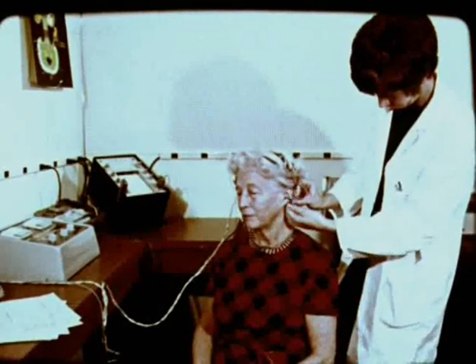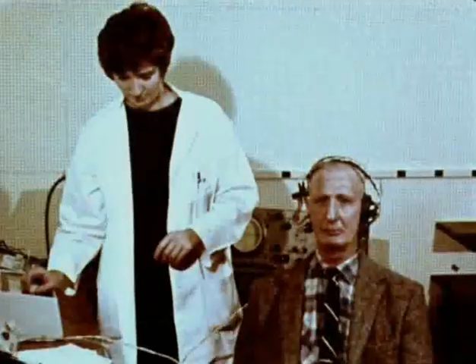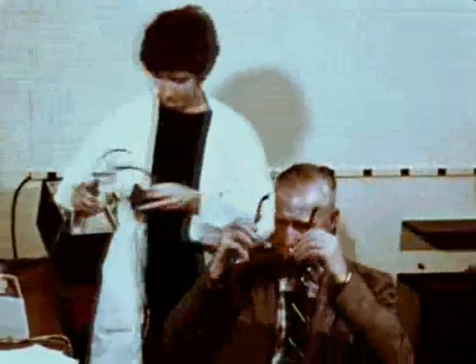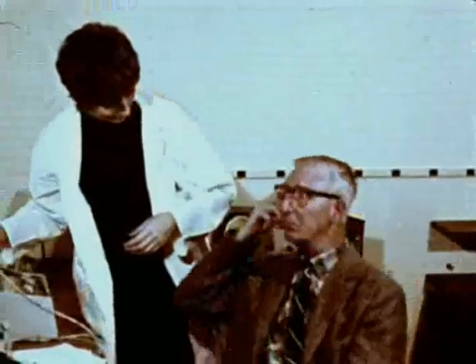Finally, perhaps its most valuable feature is that it does not rely on patient response. It provides an objective method of assessing the function of the middle ear.